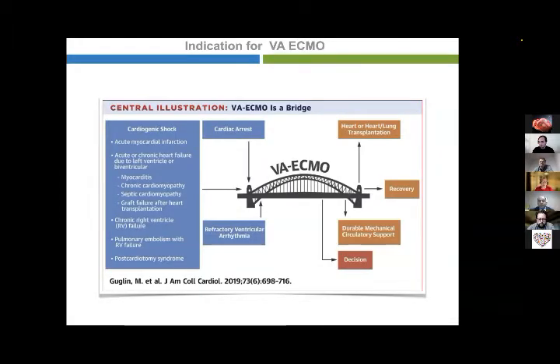VA ECMO is a bridge to recovery, to transplant, or to durable mechanical circulatory support. It's a bridge to decision as well. We have several indications for using VA ECMO in clinical practice, mostly cardiogenic shock after acute myocardial infarction, as the previous speakers told us. So I will skip this slide again.